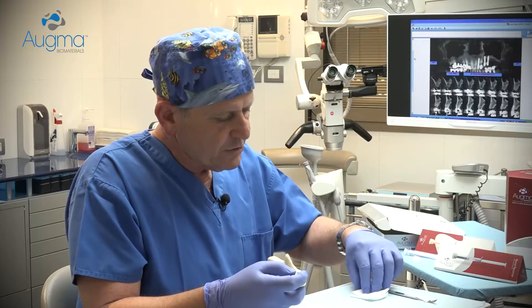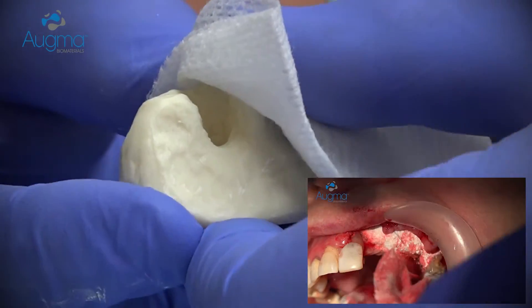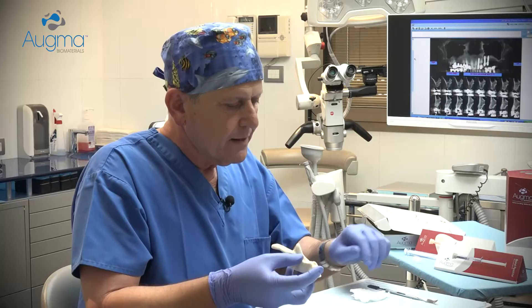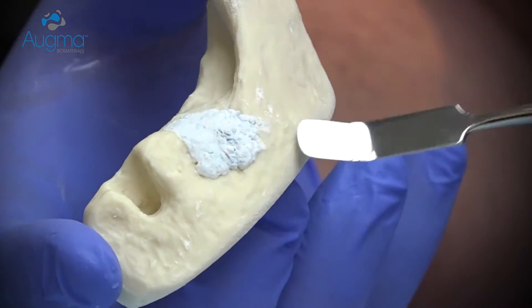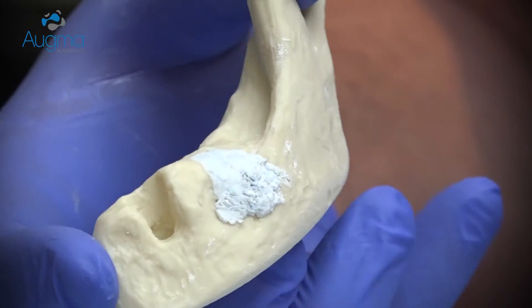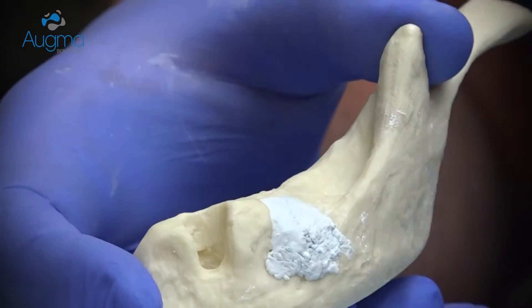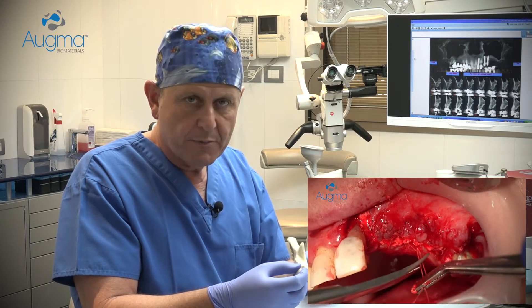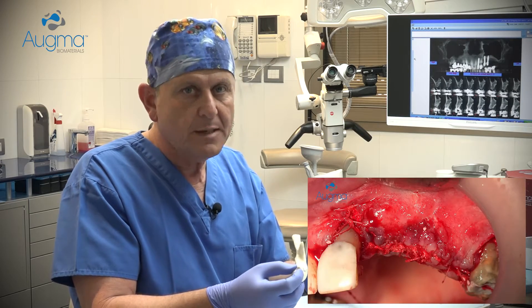At this stage, take a dry gauze, place it above the cement, and press it firmly for three seconds. Now the material is already well stabilized. If you need to shape it, you can shape it a little bit and press it again for three seconds, then close the flap. However, it's very important that your soft tissue is primarily closed and well sutured. That's all — simple as that.